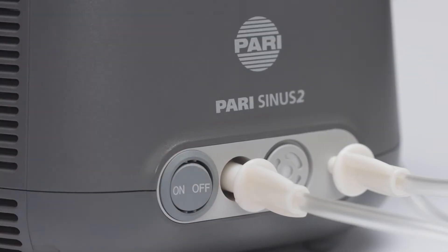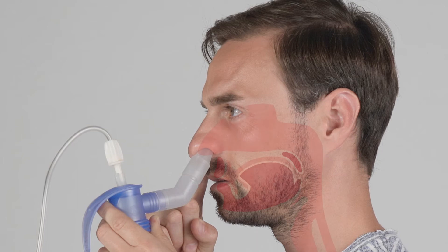Sit in an upright and relaxed position. Switch on the device. Close off one nostril with the nose plug or slightly press it gently with one finger. Position the nebulizer against the other nostril. Make sure your soft palate is closed.